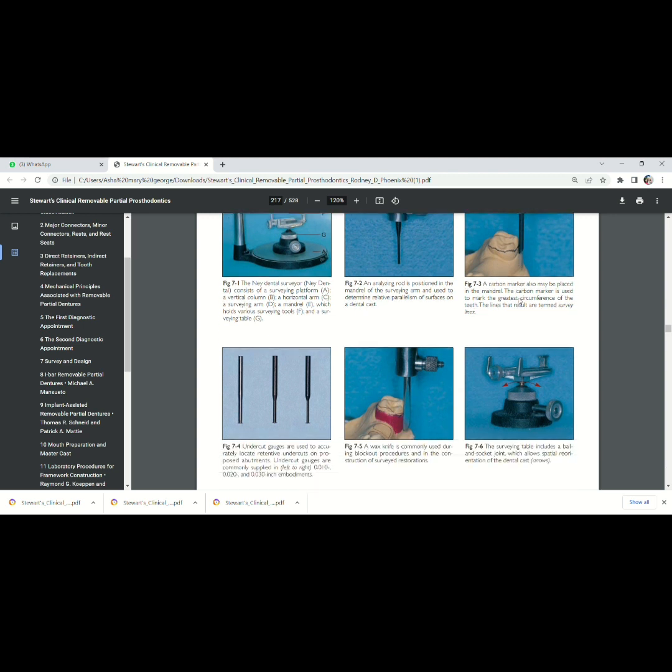Now, what is the use of wax knife? Wax knife is used in block out procedure. What is a block out procedure? We will see later. And as I said earlier, this is the cast holder.